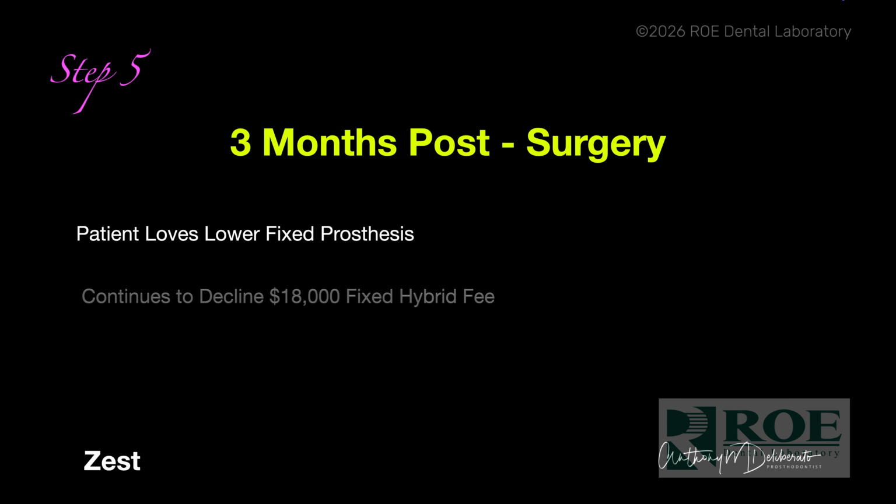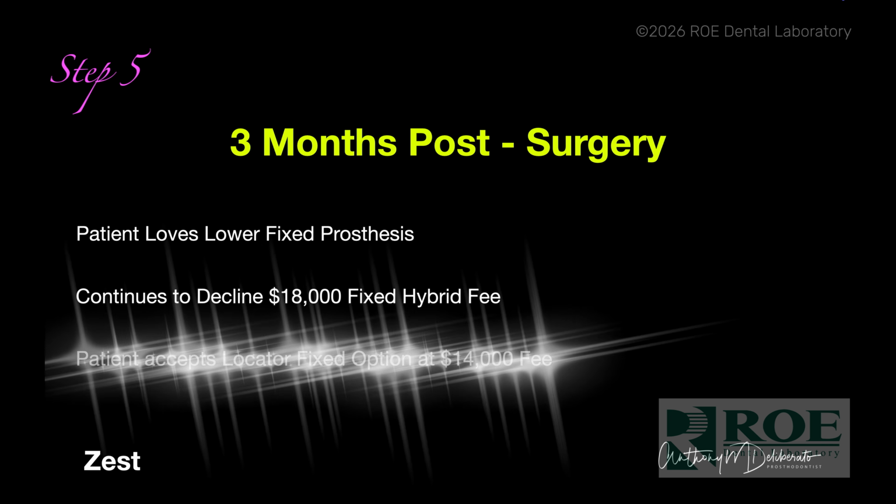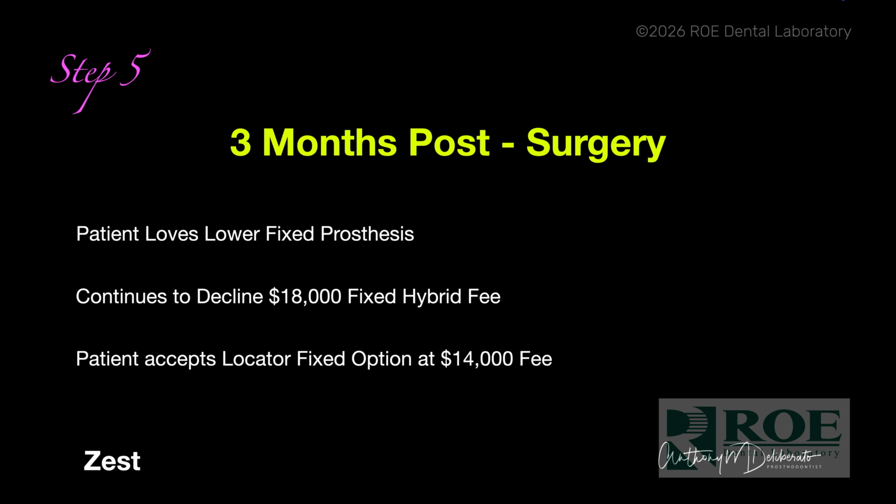3 months after surgery, the implants are healed fine. The patient loves having that lower fixed prosthesis, but she continues to decline a screw retained type of prosthesis. And it was about that time that Straumann approached me along with Zest about trying out the LOCATOR Fixed. And because I was able to do this at a decreased fee, the patient was more willing to accept that fee, and so she agreed to proceed with the LOCATOR Fixed on the lower.